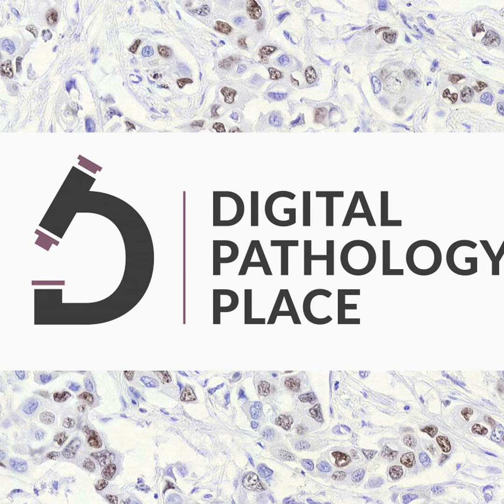Whereas DICOM, having come from a clinical background, is intended to be a format and a protocol that allow for management of the images such that the metadata is included within the image header. So the metadata in a DICOM image header says who the patient is, who took the image. What's an image header? Header is just the text or binary information that accompanies the pixel data. So it's just like a description. Like a description. So for example, in a JPEG file or a TIFF file, there'll be tags that say the number of rows and columns and how many bits there are in the image pixel data. There are additional tags in DICOM that are defined to encode who the patient is. So that's put into the header of the image because it's usually in front of the bulk pixel data.